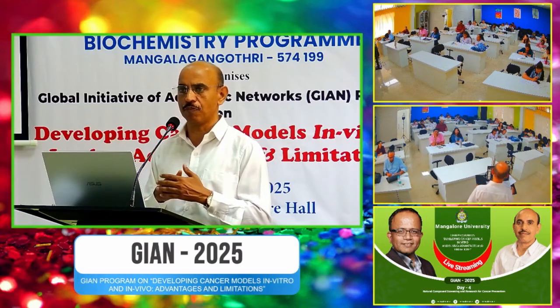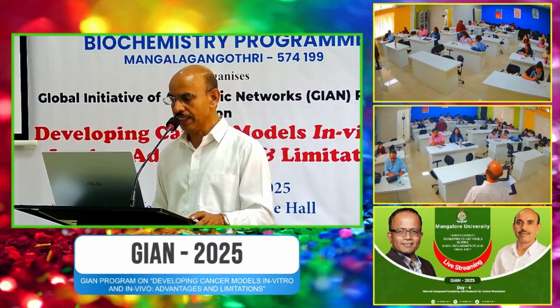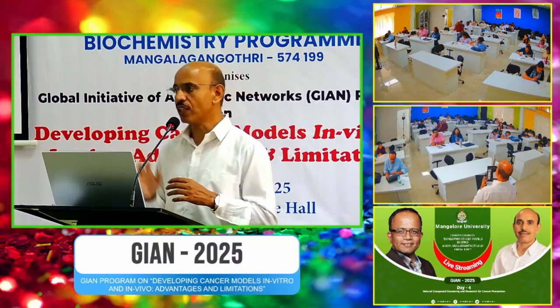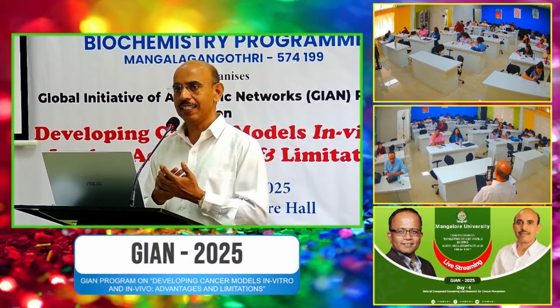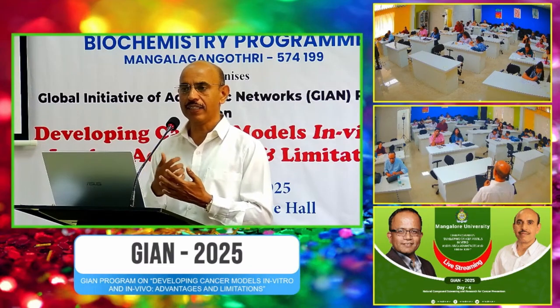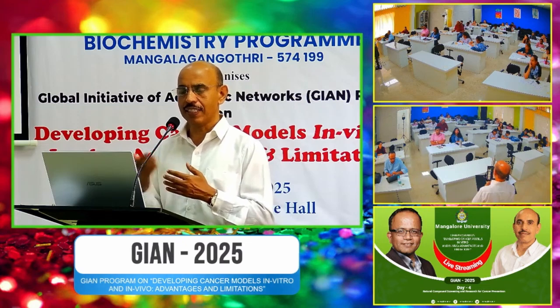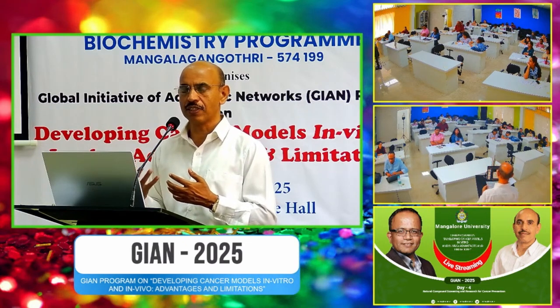We are using trypsin EDTA, and phosphate buffer saline we usually use for washing the cells, because if the cells are to be detached, and you are adding the trypsin without properly washing the cells, the trypsin may not act, because the serum might contain trypsin inhibitors.